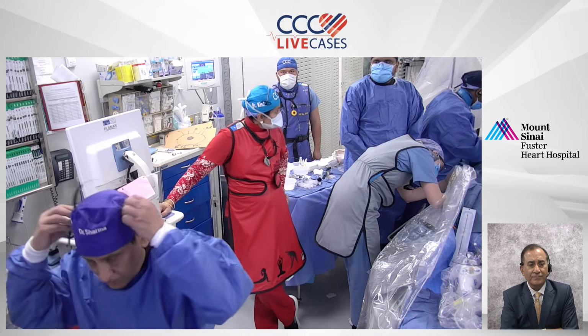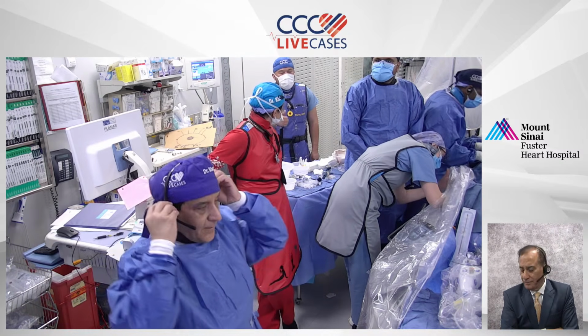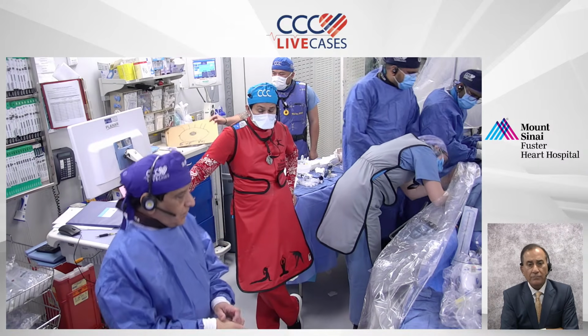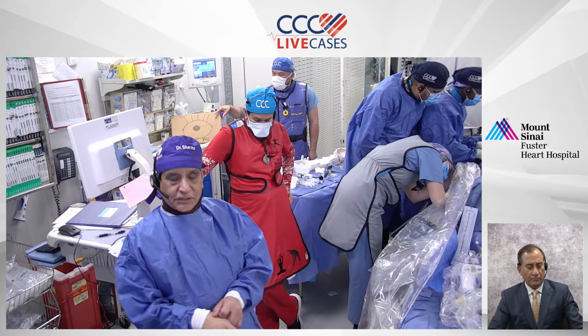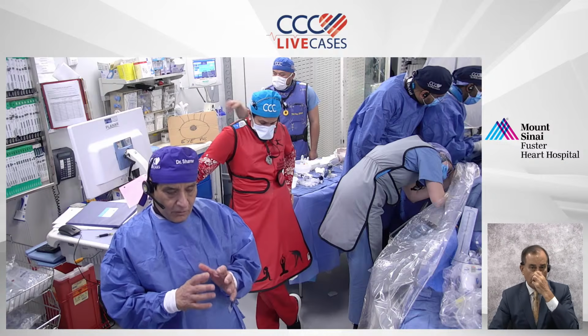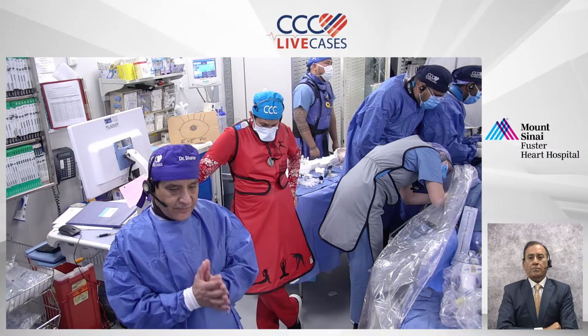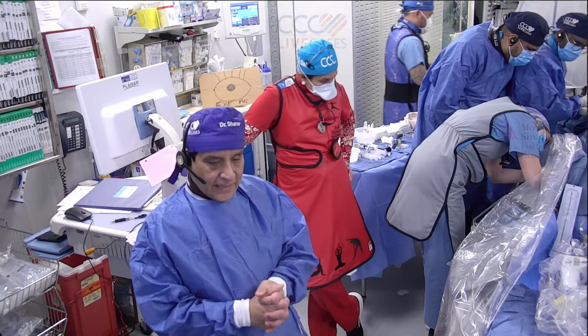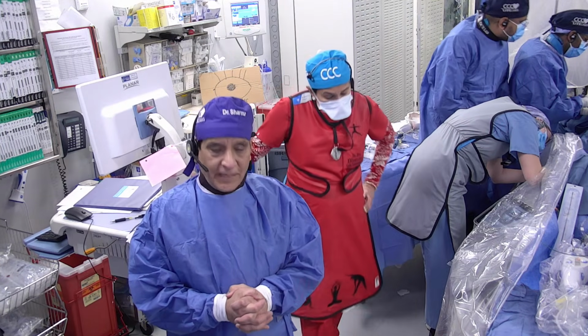Yeah, so this is the every month event which we have been doing, but then once a year, we put 9-10 complex cases together, and our focus is calcific lesion. Of course, the left main bifurcations and calcific lesion and some with the Impella support.